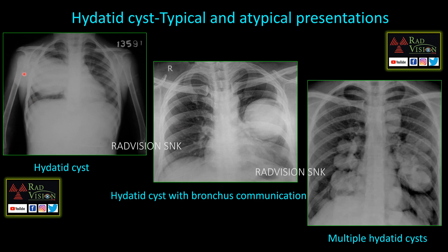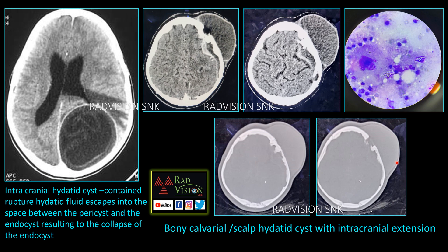These are other typical hydatid cysts in the lung. This is a hydatid cyst with a fluid level noted within, likely representing hydatid cyst with bronchial communication. These are multiple hydatid cysts in the lung. Here is another case showing a cystic lesion in the parietal lobe with typical fluid collection between the pericyst and the endocyst, with detached laminated membranes typically mimicking the water lily sign or water lily appearance.